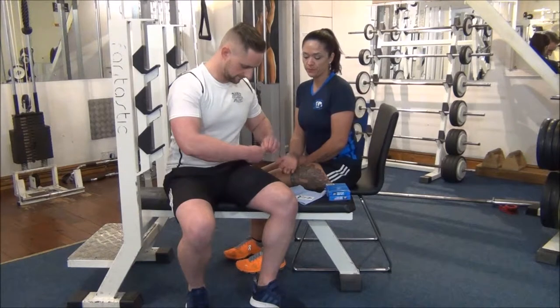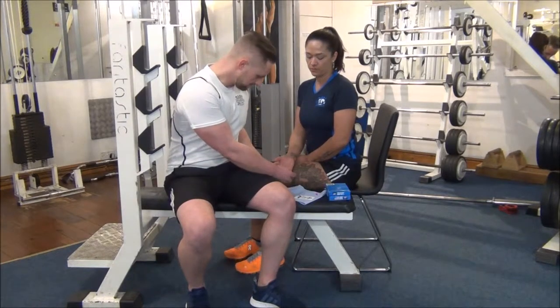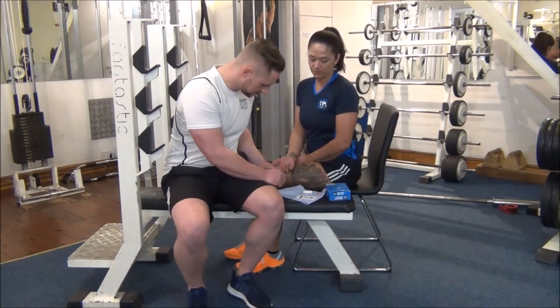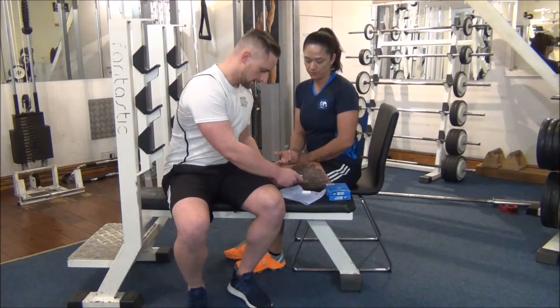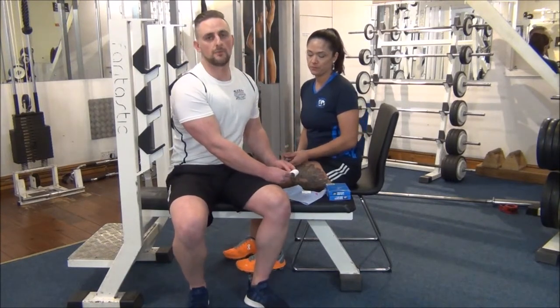We're just going to slide them down like that. Make sure they take a little bit of blood there. It sometimes takes a couple of seconds just to get enough. And then we'll put it onto the spot on this chart here. Then we now have to wait for three minutes and then we can look at the results.